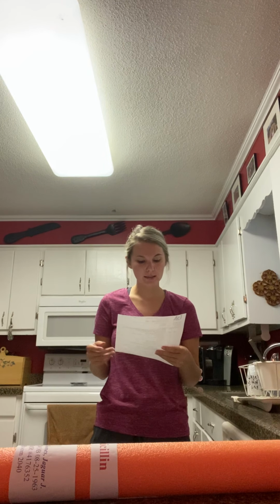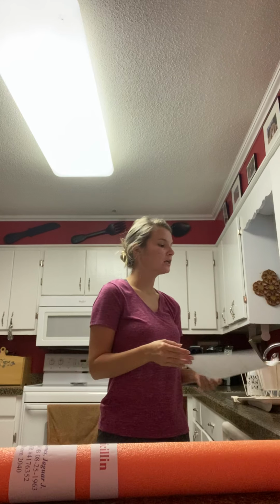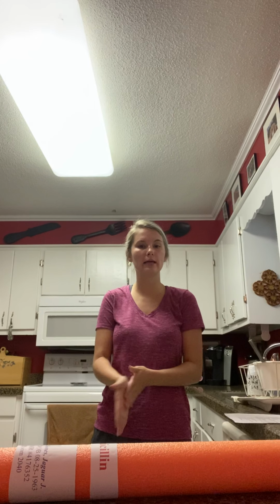I would come into the patient's room and introduce myself. I'm CJ Lorez. I'm a student nurse here at the College of Nursing, and I'm going to be inserting an IV today. I would check the orders to see that I have to insert a saline lock in the morning for a CT scan. I would check the hospital policy. I would gather my equipment and perform hand hygiene.